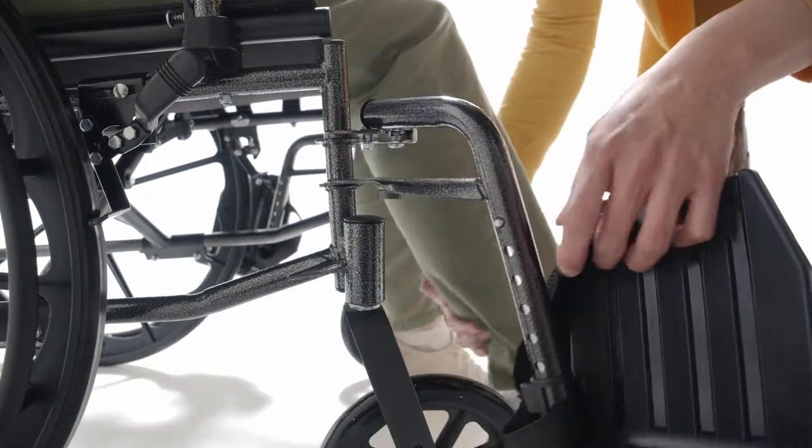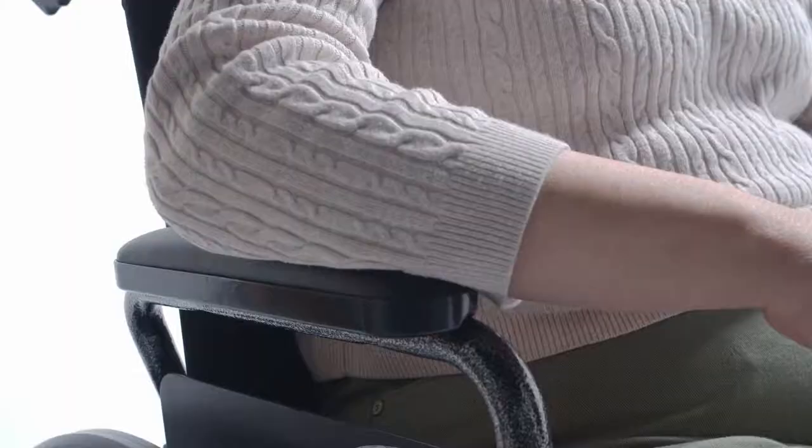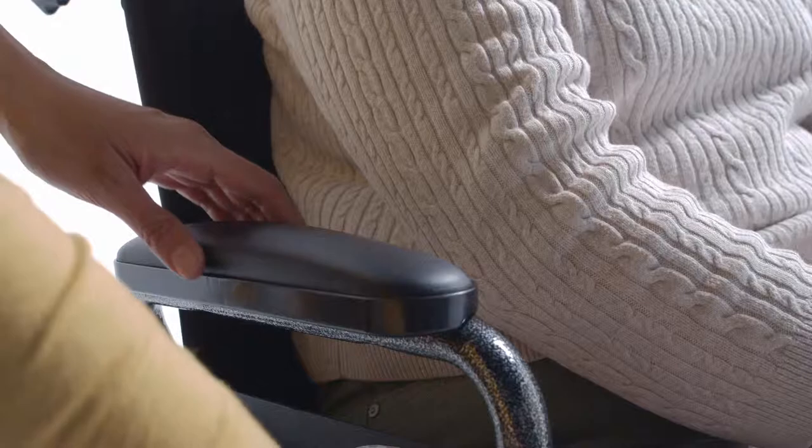The L4 comes in black nylon upholstery with tool-free adjustable front rigging and black composite footplates. Heel loops are standard on swing-away footrests.